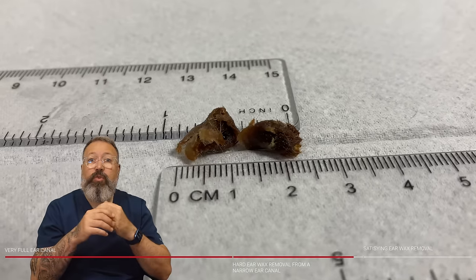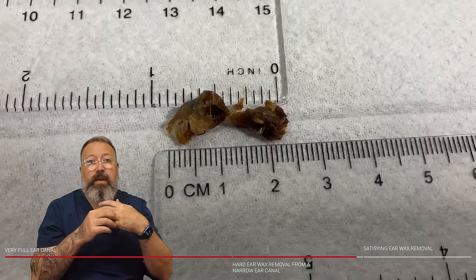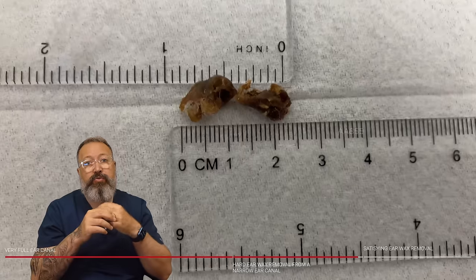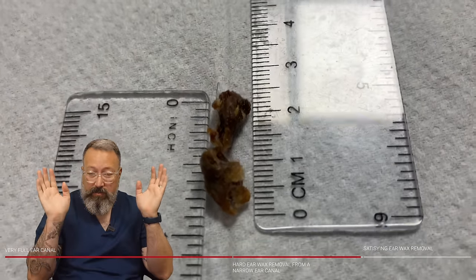Two quite chunky little pieces there — I'm going to go with seven-eighths of an inch and two and a half centimetres. And that wasn't an easy-read ruler — kudos. Thank you so much.